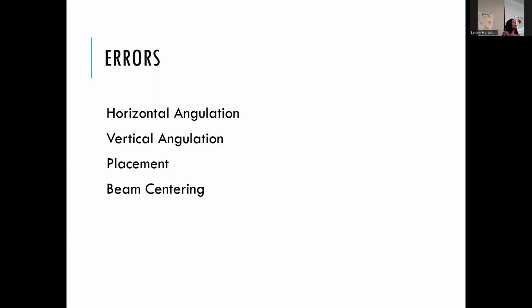And the way I eyeball that is I look at what's half of the enamel, and then I ask, is that significantly more or less? If it's a half, it's a retake. If it's significantly less than a half, we're talking less than millimeters, I don't even know exact measurements, but it's pretty small, obviously.